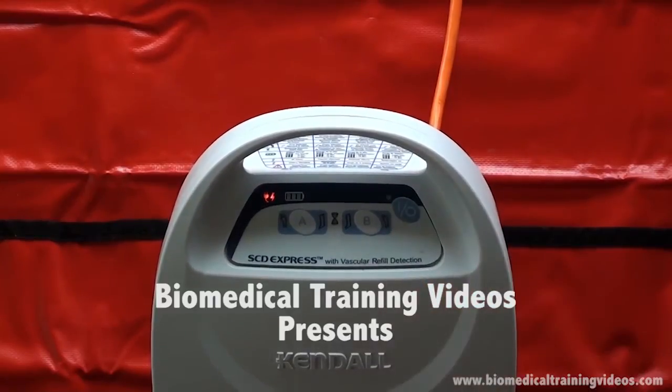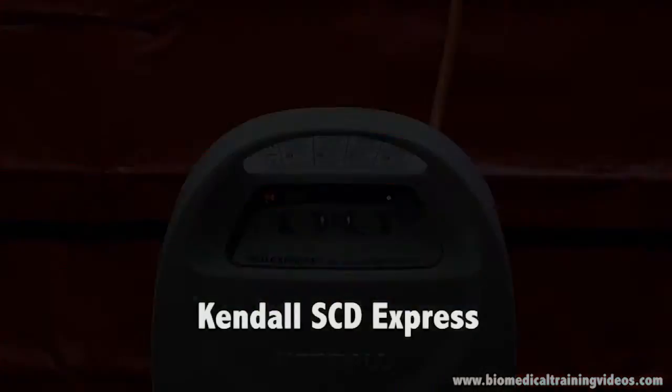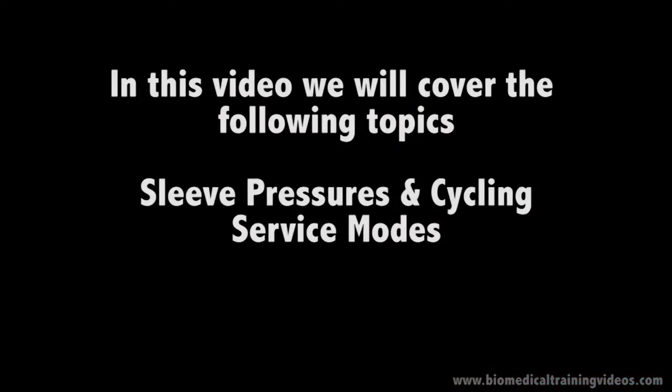Hello folks and welcome to the Kendall SCD Express. In this video we are going to be talking about sleeve pressures and cycling and also cover the service modes.